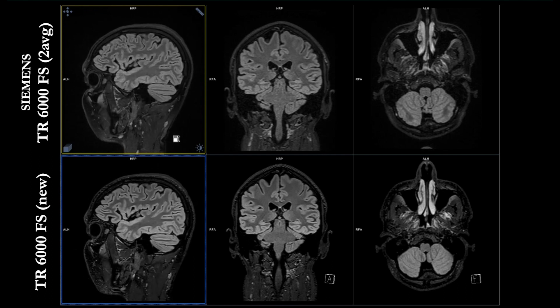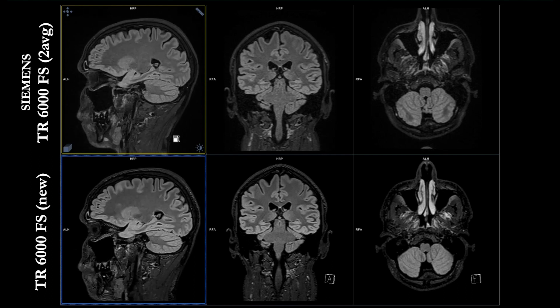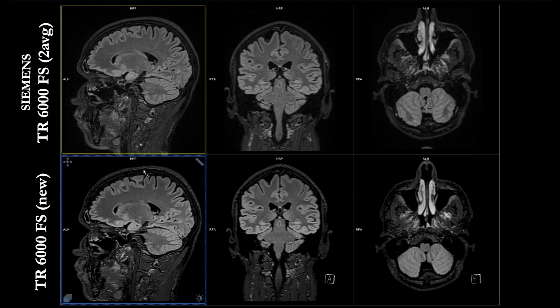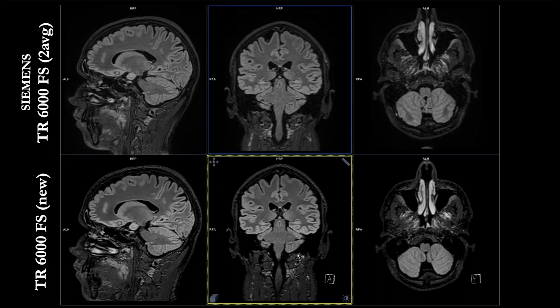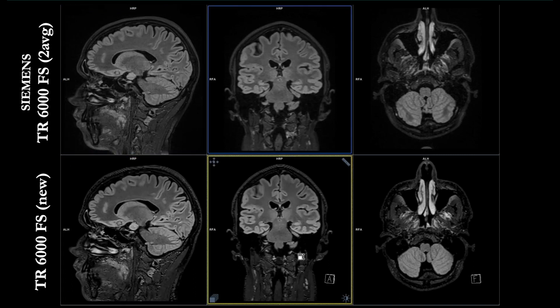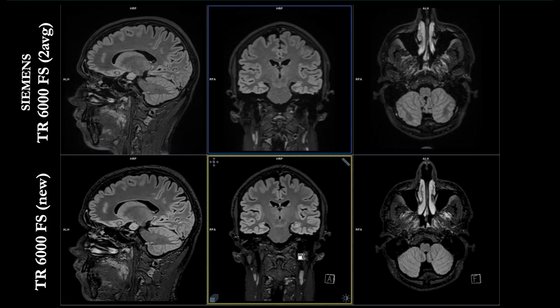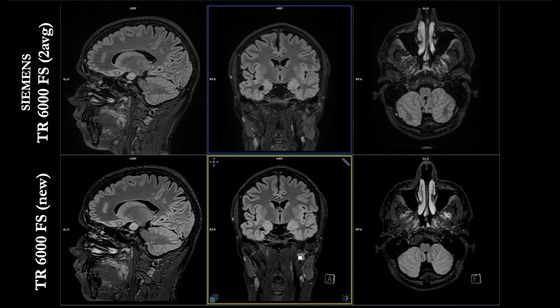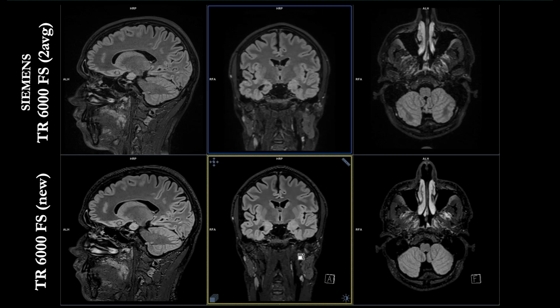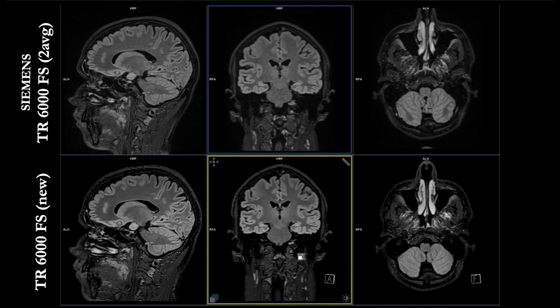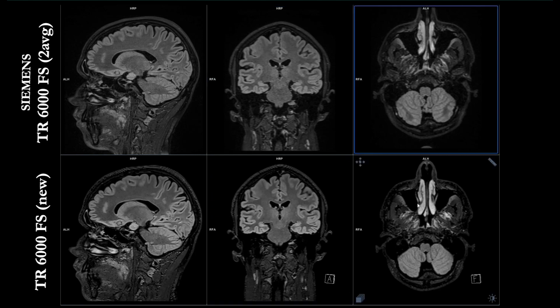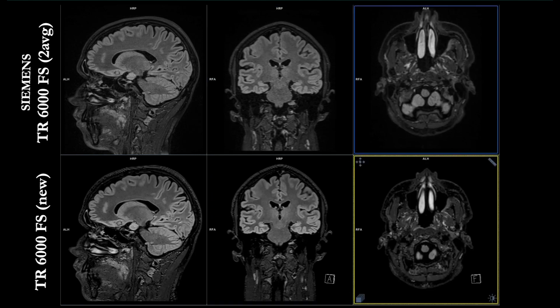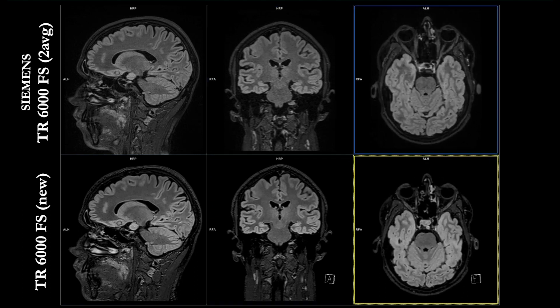You can see the overall image quality and decide what is the best, upper row or lower row. Let's check the coronal right here. Scan time is approximately the same. You both have fat sat on. Let's check the transversal plane right here.